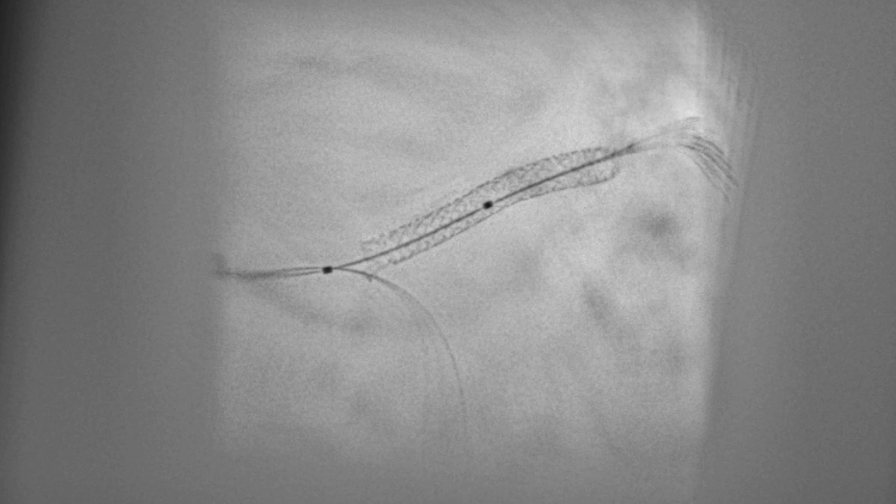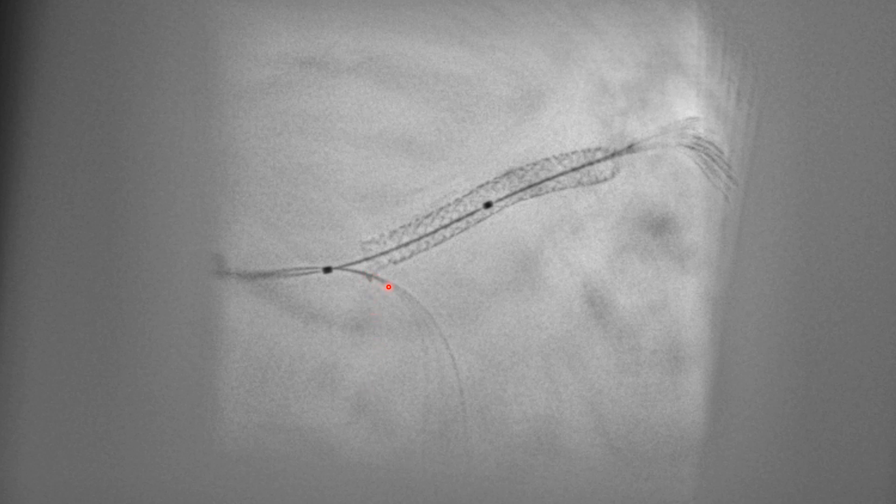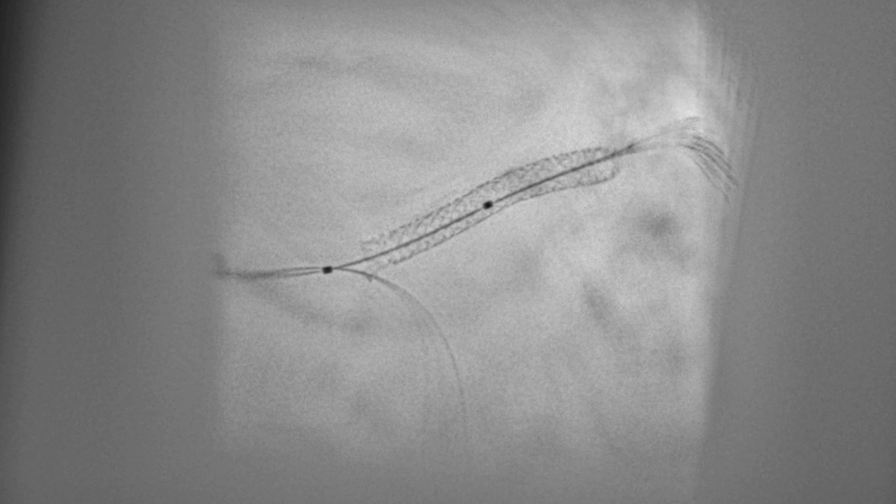Dilatation was done sequentially with 1.5, 2.5, 3, and 3.5 mm balloons to open the struts of the stent. Another stent enhancement was done, this time putting the balloon marker into the LAD stent. It showed that our wire was actually passing into the most proximal struts of the LAD stent, which is the negative part. So the procedure is going to be actually a mini-culotte technique.